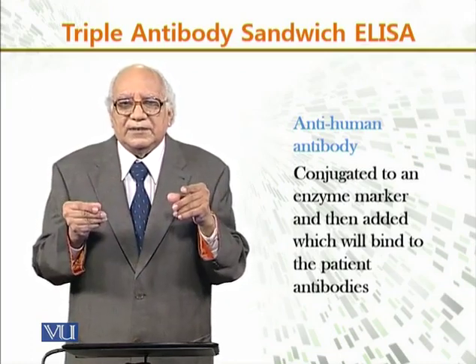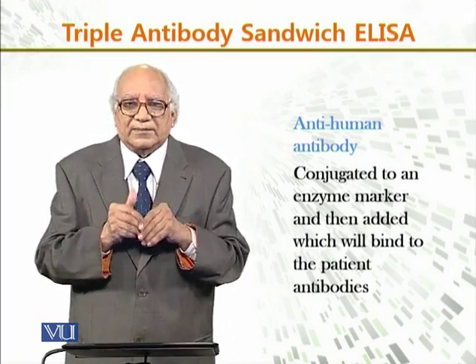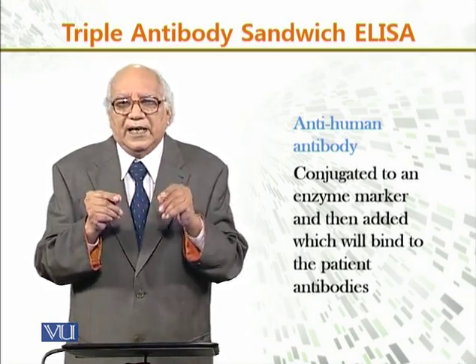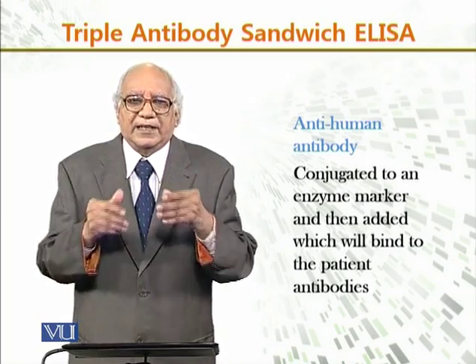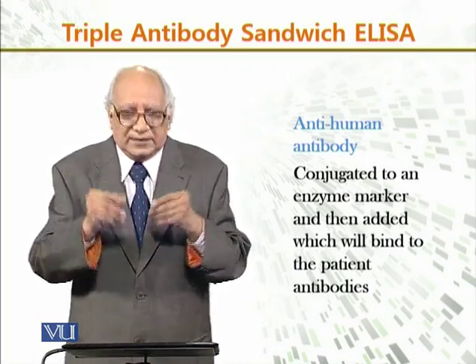By enzyme marker we mean any enzyme which can become a marker, an indicator. It is added and it will bind to the patient's antibodies which are there.